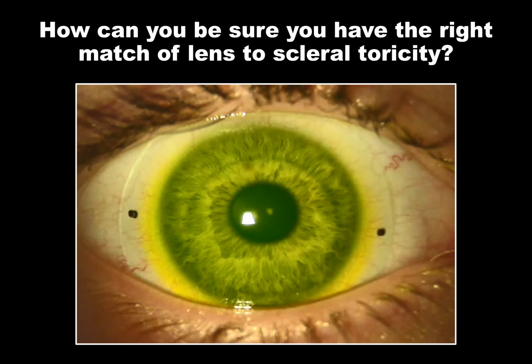That was completely clear, but also just to make sure that the doctor understood, the markings can also guide you, doctor. So for example, when you're fitting a patient and you tell us that the markings are 3 and 9, or whatever the markings rotate to, please let us know so that we can design the lens, and we can design a front toric lens based on the rotation that that lens had on the patient's eye.